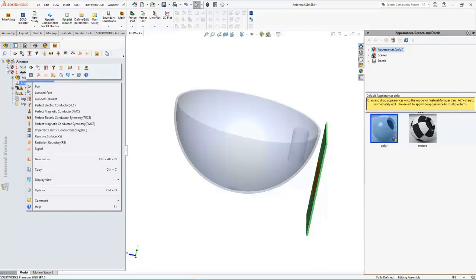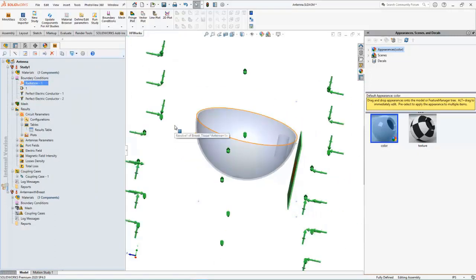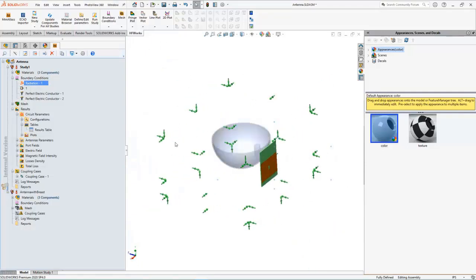In this antenna case, the radiation boundary has to be applied on the outer faces of the air part that surrounds the structure.